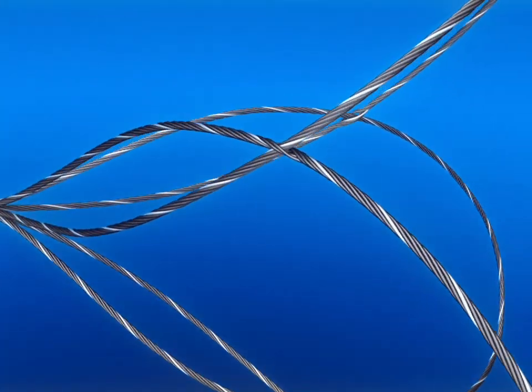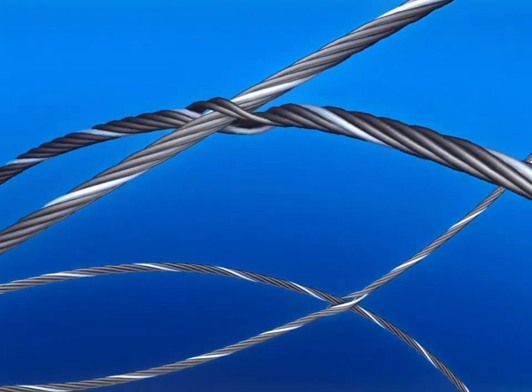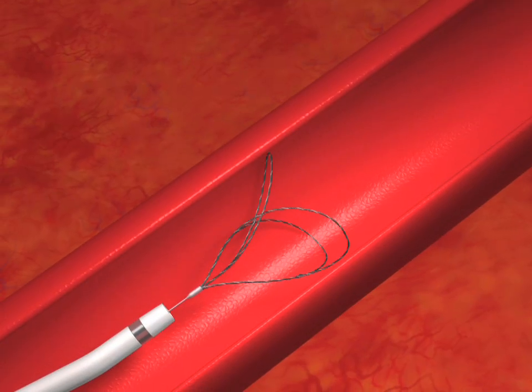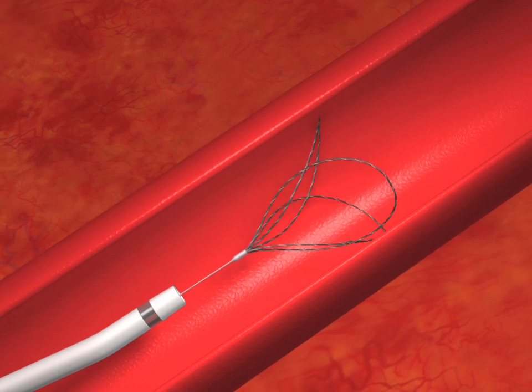The loops of the N-Snare are interlaced for structural integrity and are self-sizing for excellent vessel coverage.